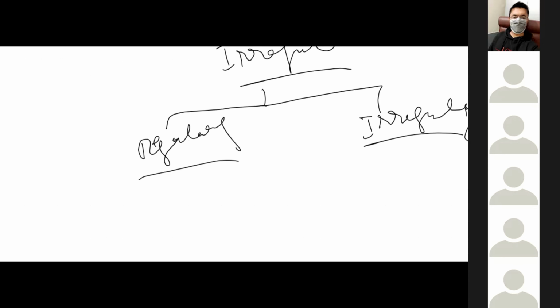So the normal axis of the heart lies in between. This is the normal axis of the heart, because if you see the placement of the heart, the heart's tip is almost somewhere like this. So this is how this thing is interpreted.